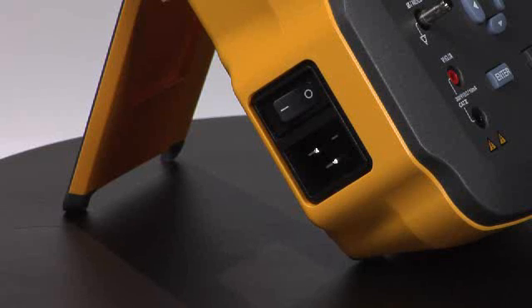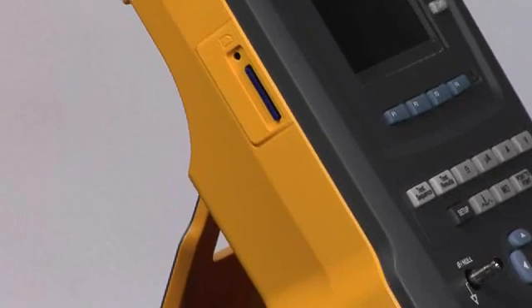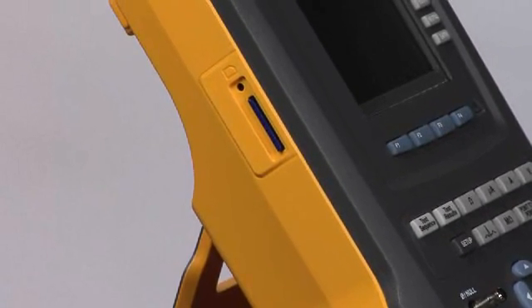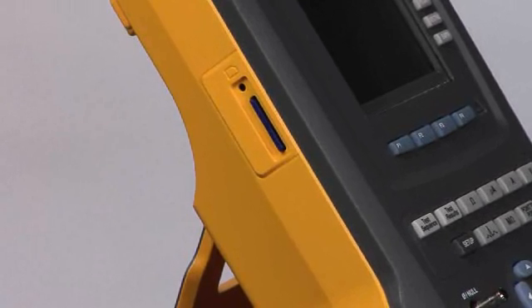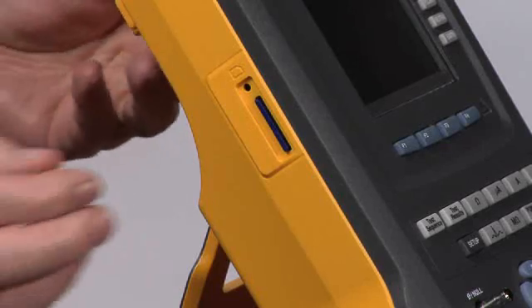On this side of the device we see the mains power connection. Power cords are available and shipped based on your geographic location in the world, along with the power on/off switch. Moving up a little higher on the unit, we see the SD card for expanded memory storage of both test results and test sequences.